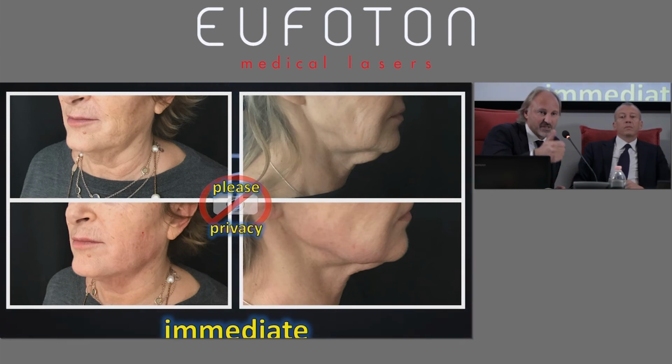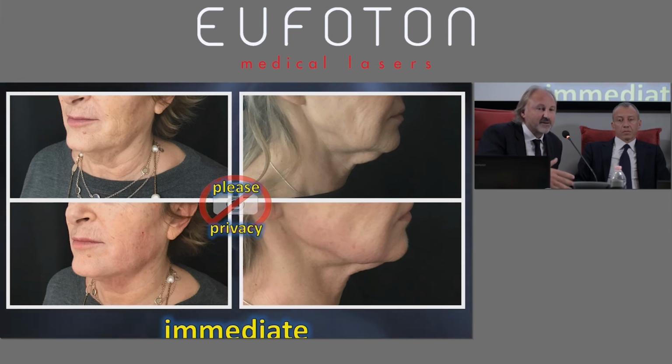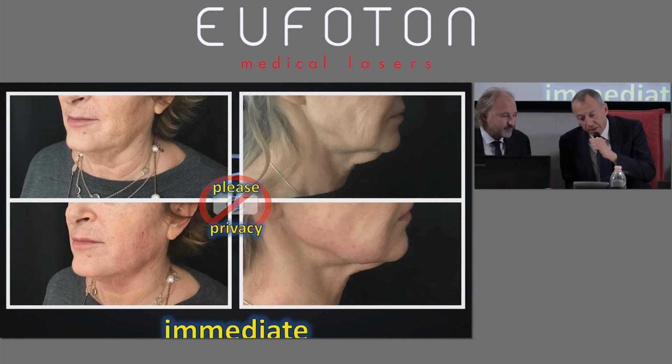But that's a plus you can decide to use if you have the necessary skills, because these participants are not just surgeons but also colleagues who use the traditional Endolift. If you have the manual skills, you can safely use it with a surgical approach, combining it with surgery.